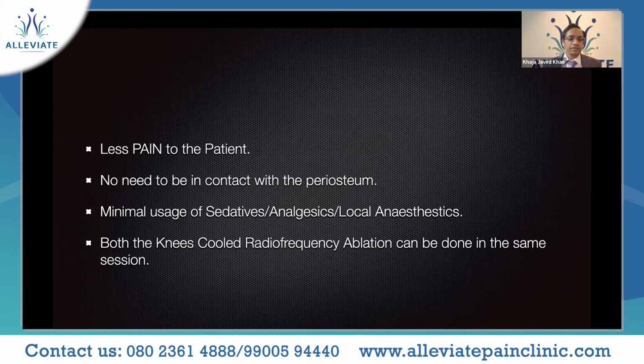If the pain is less, there is definitely minimal usage of sedatives, analgesics, and local anesthetics. And cool radiofrequency ablation, as I said, is more preferred than the conventional. Both knee cool radiofrequency ablations can be done in the same session most of the time if you are using the ultrasound.